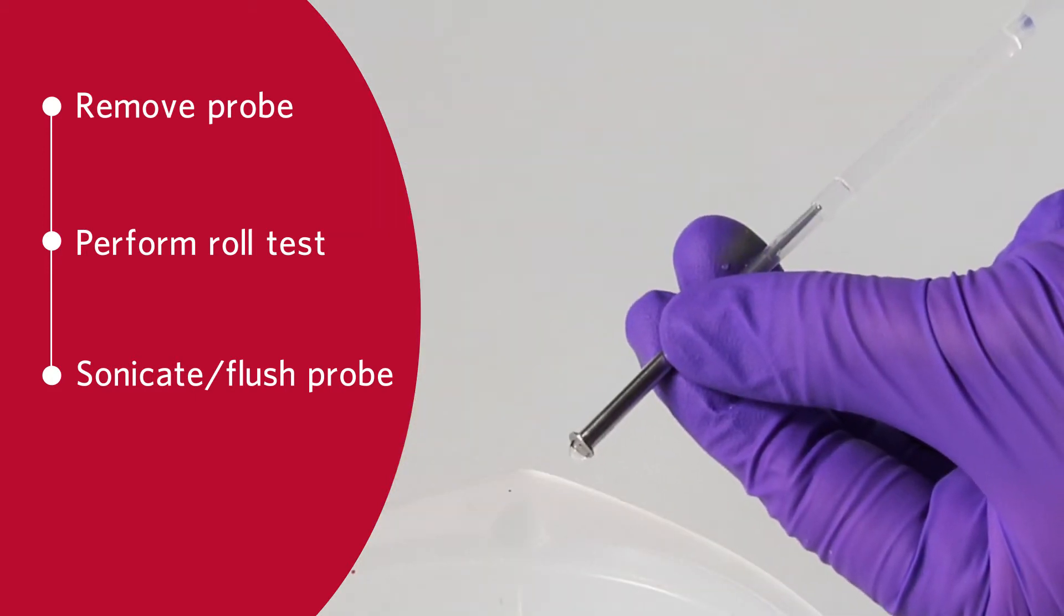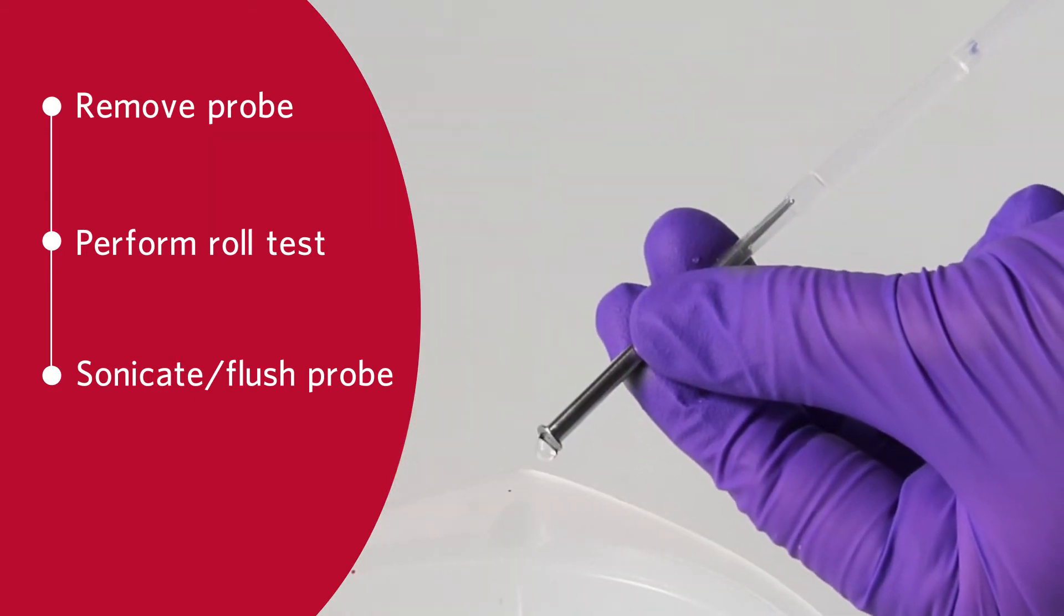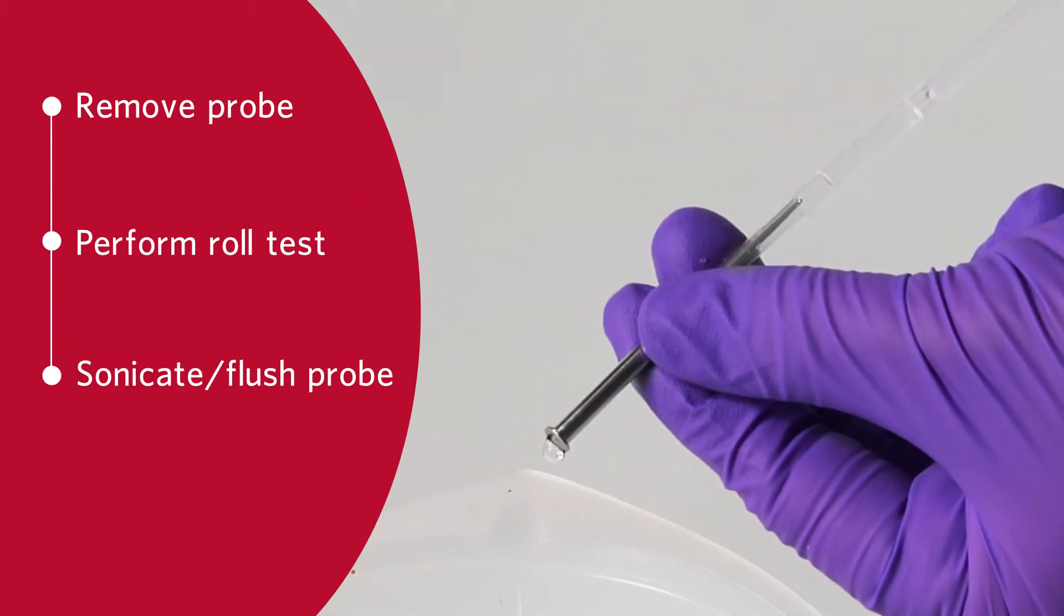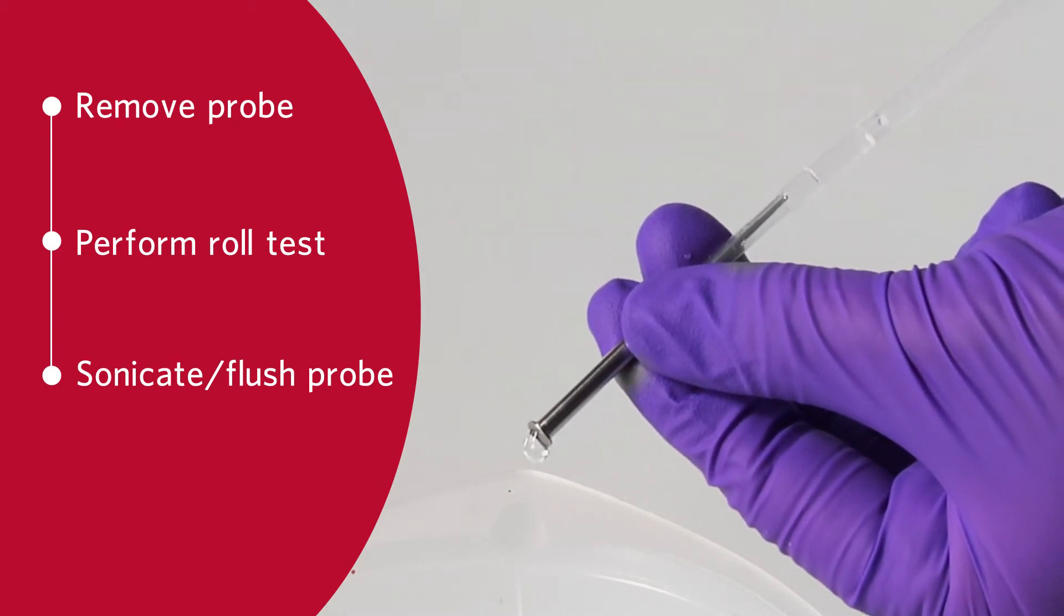If using a syringe, force distilled water through the tip of the sample probe to its large end. This dislodges any debris clogging the tip.